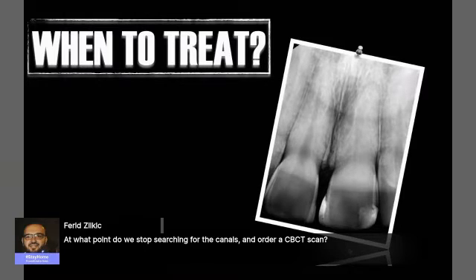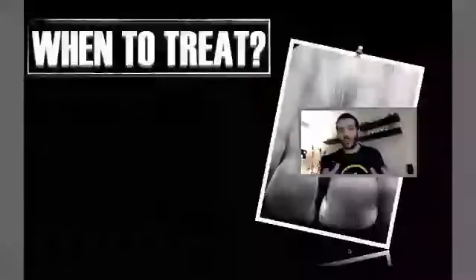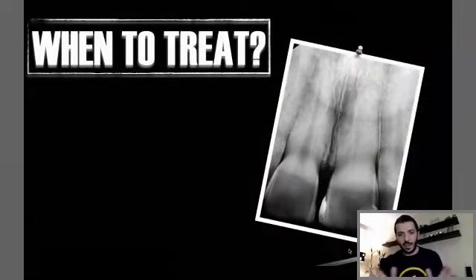And in calcified teeth, I always try to open the tooth directly without CBCT. Then, when I cannot find any root canal orifice or I feel that I am lost, I can inject some radio-opaque materials such as maybe bioceramic sealer or calcium hydroxide. Just inject inside the pulp chamber and do the CBCT.